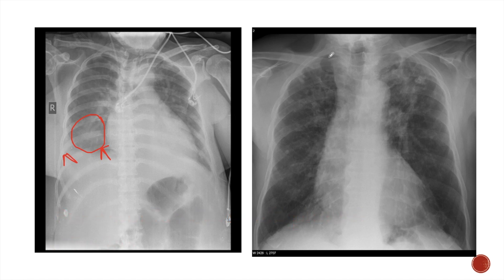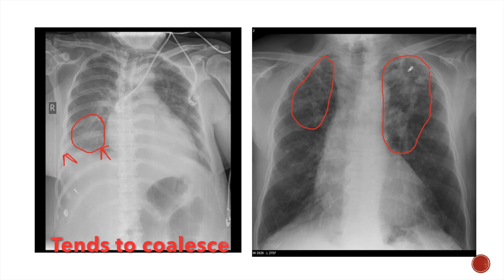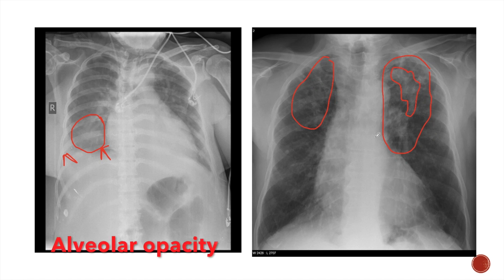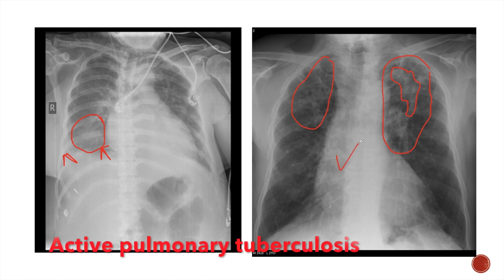Now look at the second X-ray. In the second X-ray we can see opacities in both the upper zones, more so in the left upper zone. The opacity also tends to coalesce, forming a patch in the left upper zone. This is also an alveolar opacity. This was a case of active pulmonary tuberculosis.